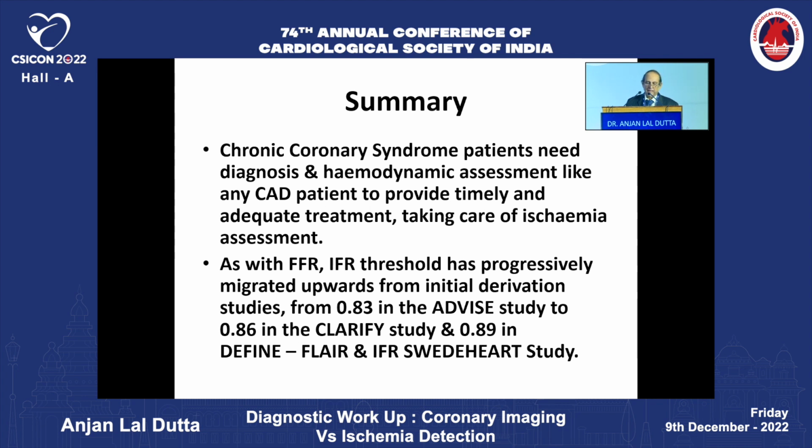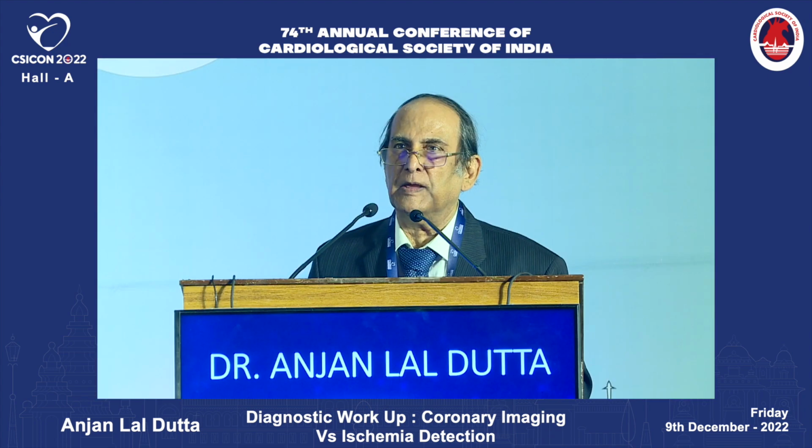As with FFR, the iFR threshold has progressively migrated upwards from initial derivation studies, from 0.83 in the ADVISE study to 0.86 in the CLARIFY study, 0.89 in the DEFINE-FLAIR study, and the iFR-SWEDEHEART study also to that level. So we now have more problems solved in terms of the threshold figure for better outcome in FFR. So thank you very much for your patience in hearing.